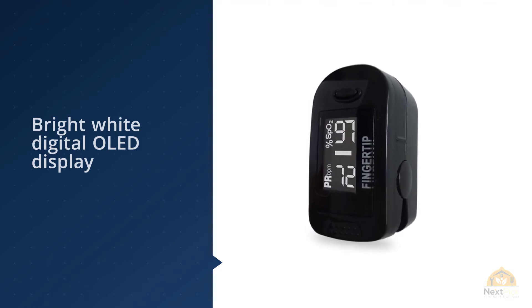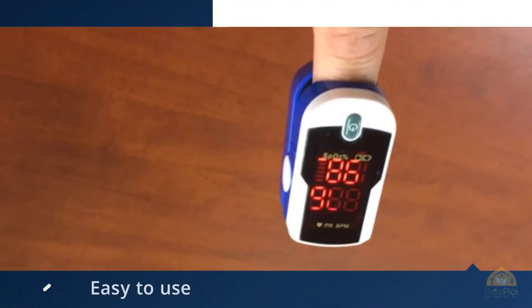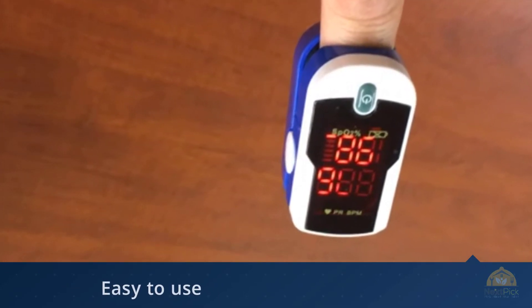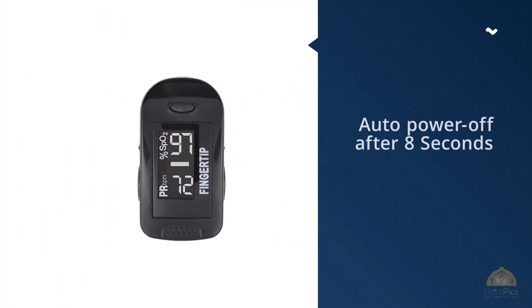With a bright white digital OLED display, the readout of the digital pulse oximeter can be accessed from two display modes — one facing you, and with the push of a button, it faces your caregiver. Flip the screen 180 degrees with one button for easy viewing.